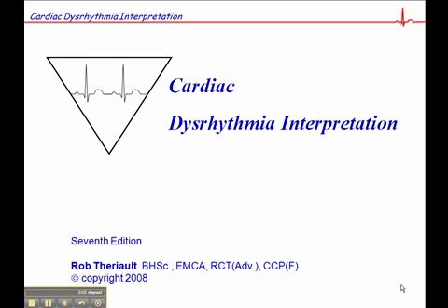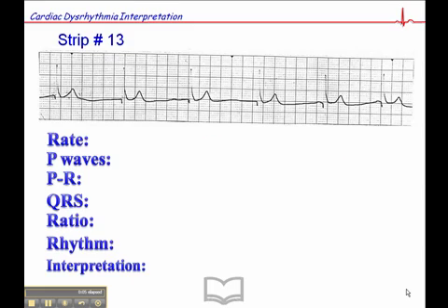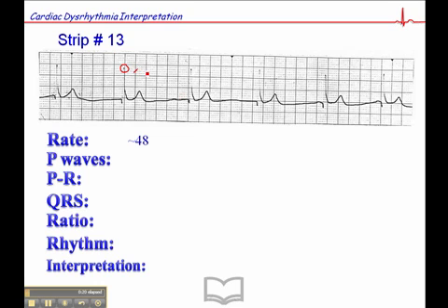We're on ECG exercise number 13 on page 91. Starting with heart rate — it's approximately 48. Mapping it out, there's a QRS that falls on a dark line. The heart rate markers are 300, 150, 100, 75, 60, 50, and 43. This falls just shy of 50, so 48 sounds reasonable.